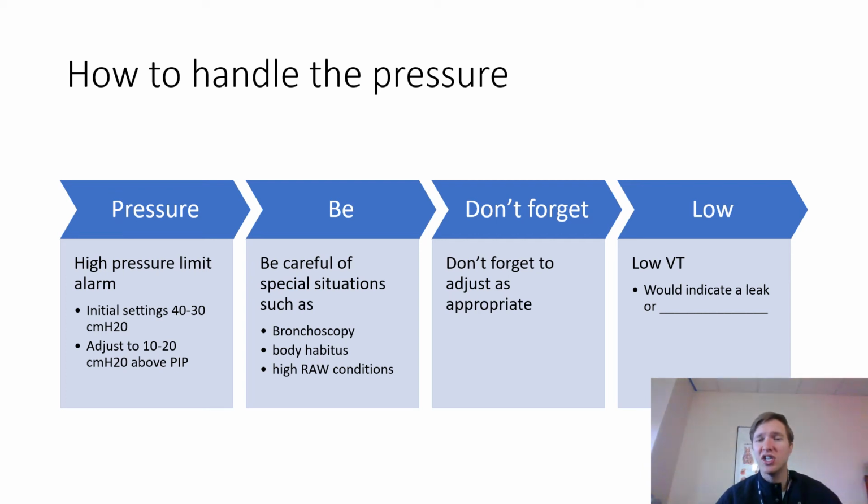Moving the chest wall and abdomen out of the way is going to create a lot of back pressure. Is that back pressure going to translate to lung trauma? Probably not, but we would probably need to see some studies on that. So things like that could play a factor there.